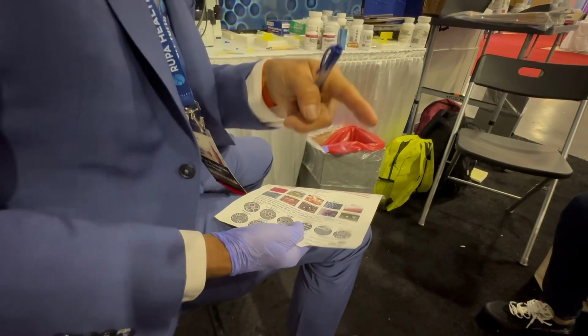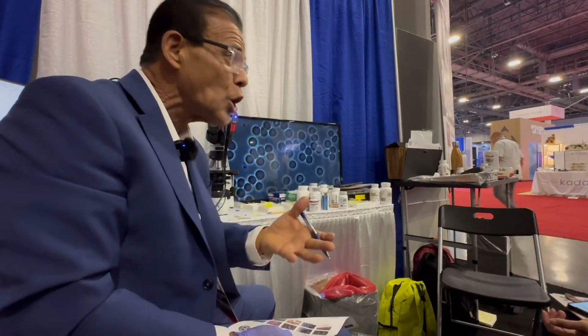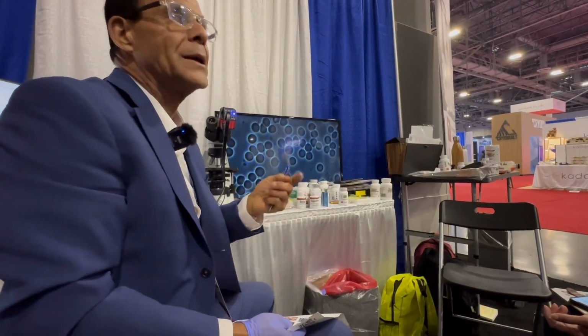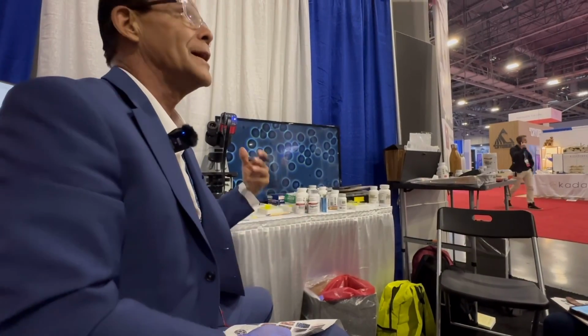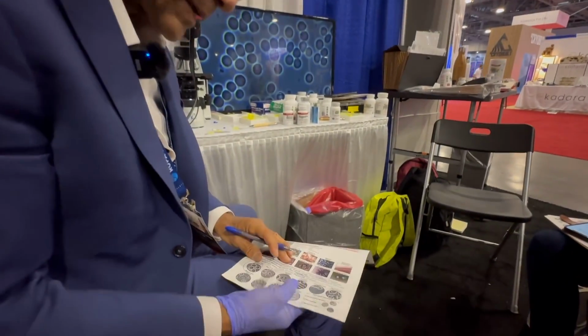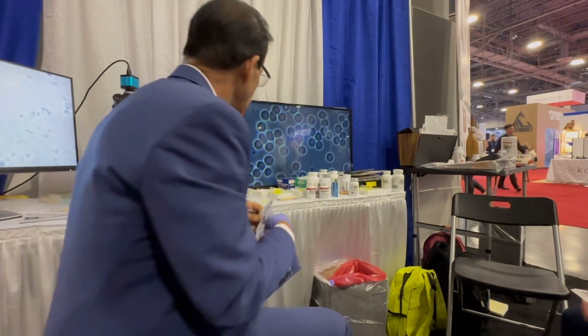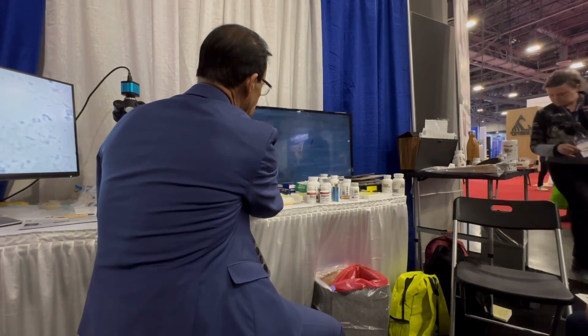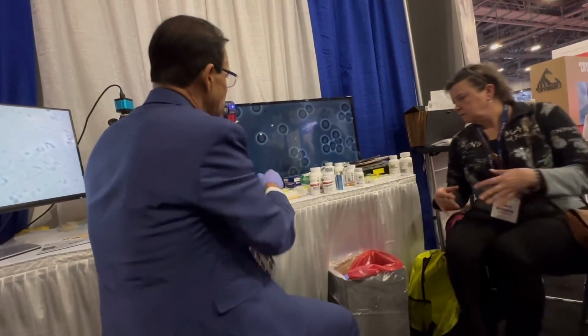And the white blood cells we said were elevated, right? Not two, but a couple more than there should be potentially. So I'm going to list it as moderate. It may be within normal limits for her, but I would observe to see why is there extra white cells? But you have a history recently of things that took place. It makes sense that that's happening. Okay, so healthy red blood cells, a slight increase in white blood cells. Did we see Candida? I did not see Candida. I don't think I have either. Okay, I don't see Candida.